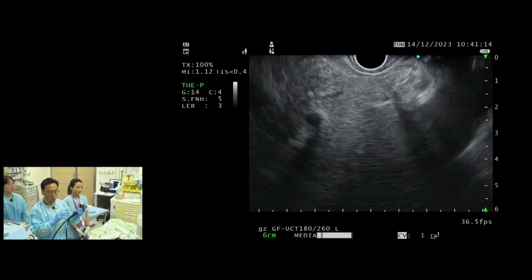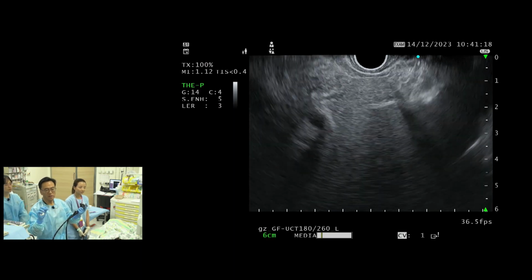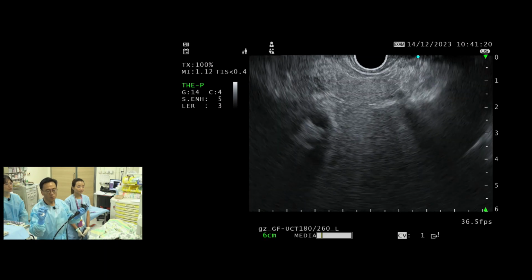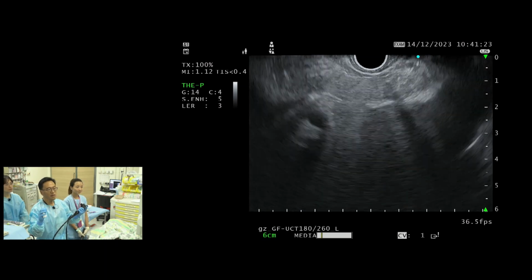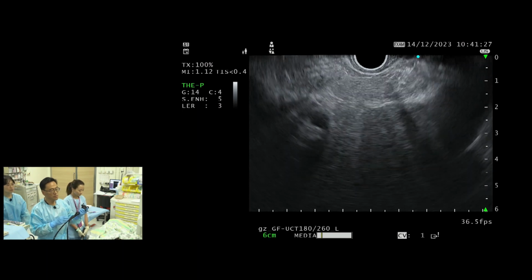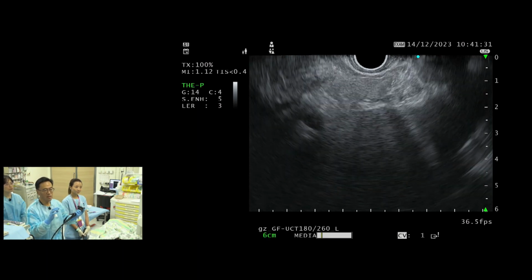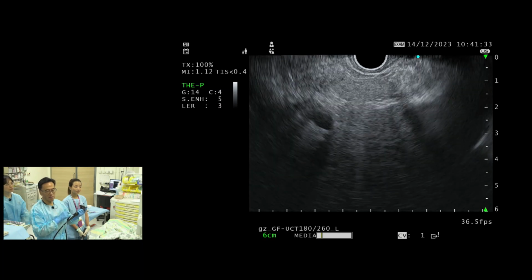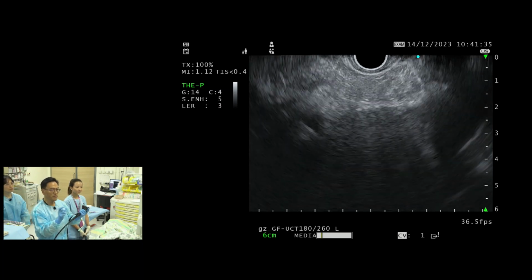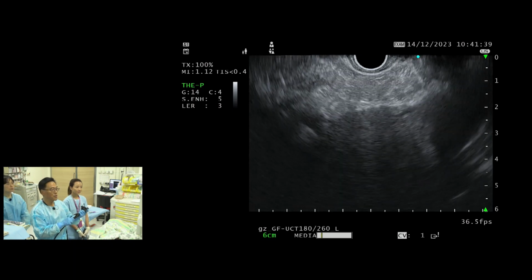But if you go way out into the periphery, where these vessels are 2, 3, 4 millimeters in diameter, then the pressure may not be the same. So we do rely on accessing the left portal vein, the umbilical portion of the left portal vein, and that is exactly the same as the main portal vein.